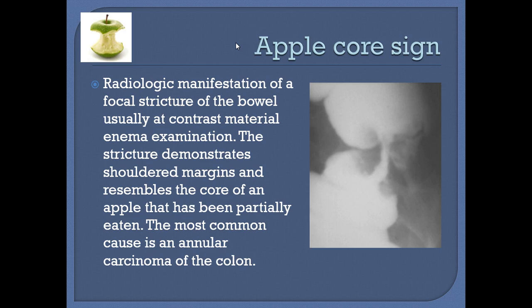So we give the gastrografin, which is soluble and easily evacuated, and if it is left, it will not form any clump or anything to obstruct further.